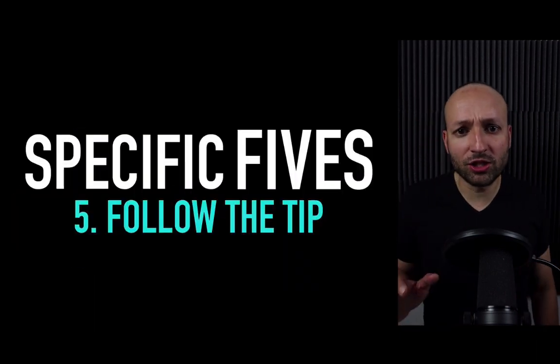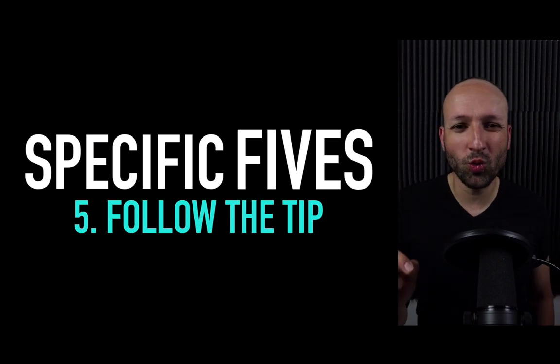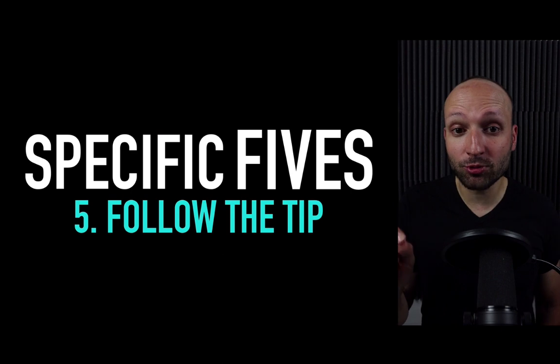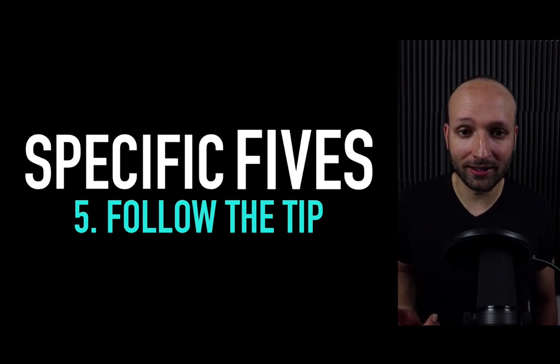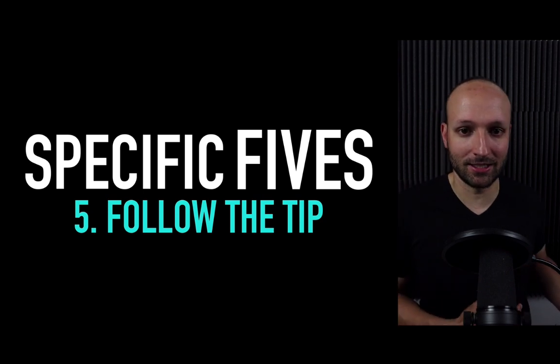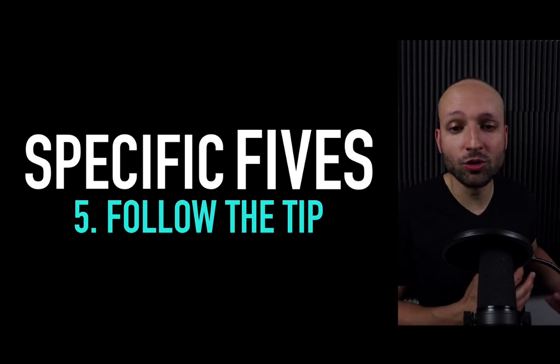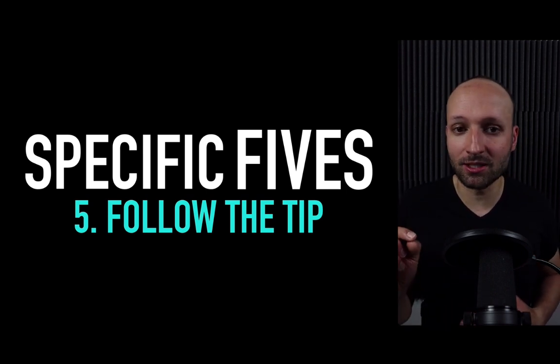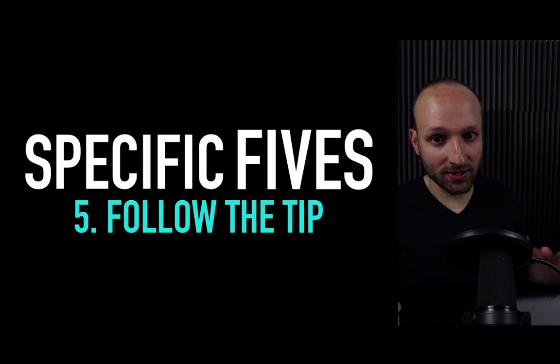Now, as far as procedural-based ultrasounds, the most important thing is to always follow that needle tip. Never lose sight of that needle tip. That's where you run into problems. If you look at the central line literature, there are still some incidences of carotid cannulation and pneumothoraces with ultrasound guidance, and I'm convinced that it happens because you don't have good technique, though accidents can happen all the time, right?